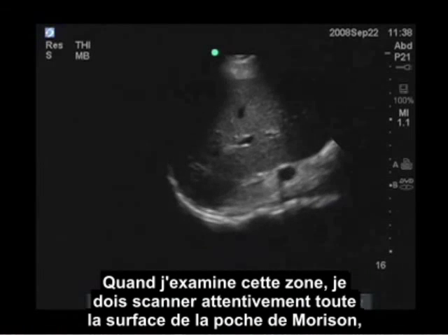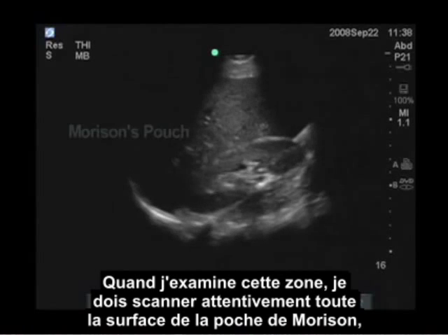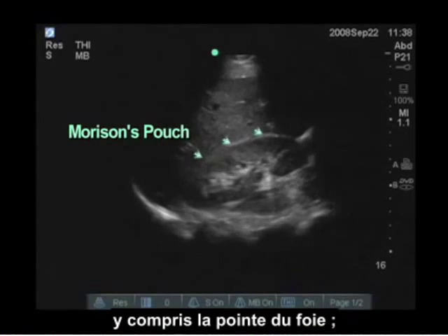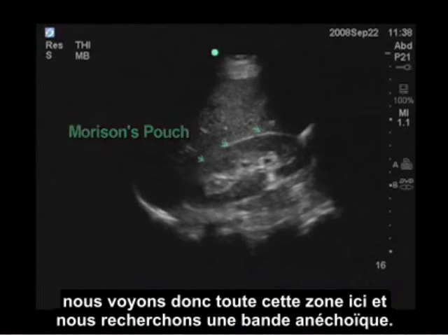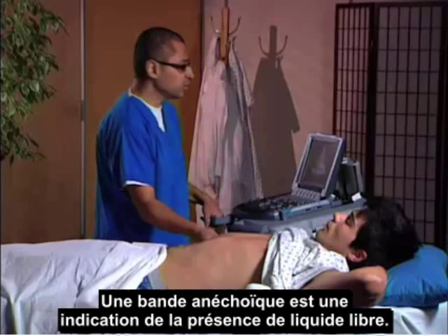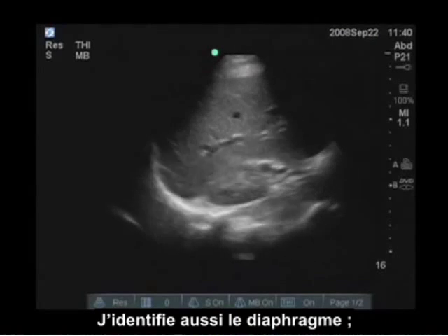When examining this area, I'm going to carefully scan through the entire area of Morrison's pouch, including at the liver tip, looking for an anechoic stripe. An anechoic stripe would be indicative of free fluid.